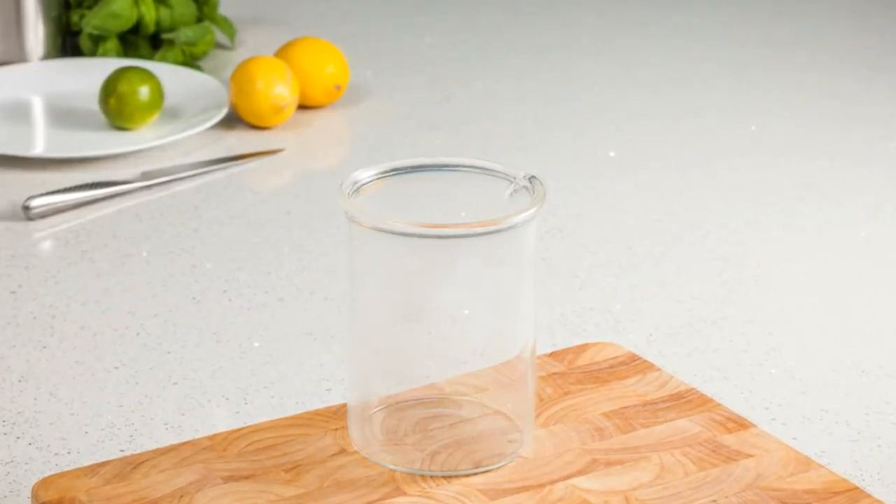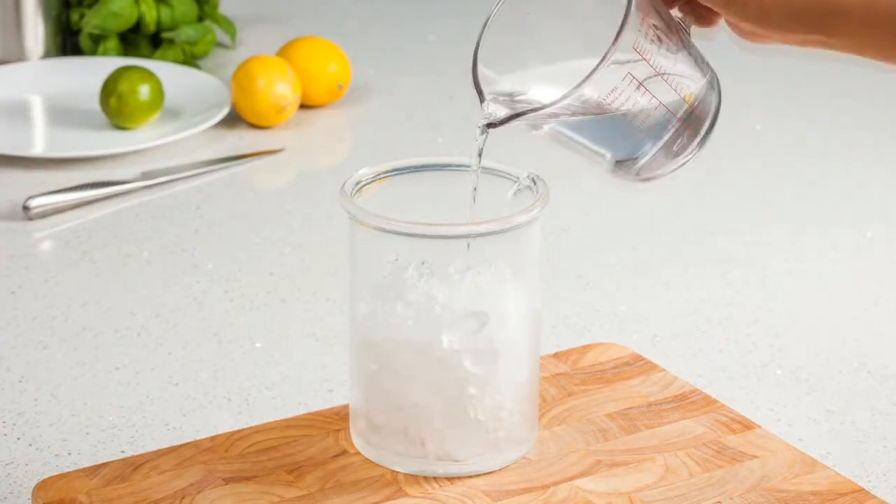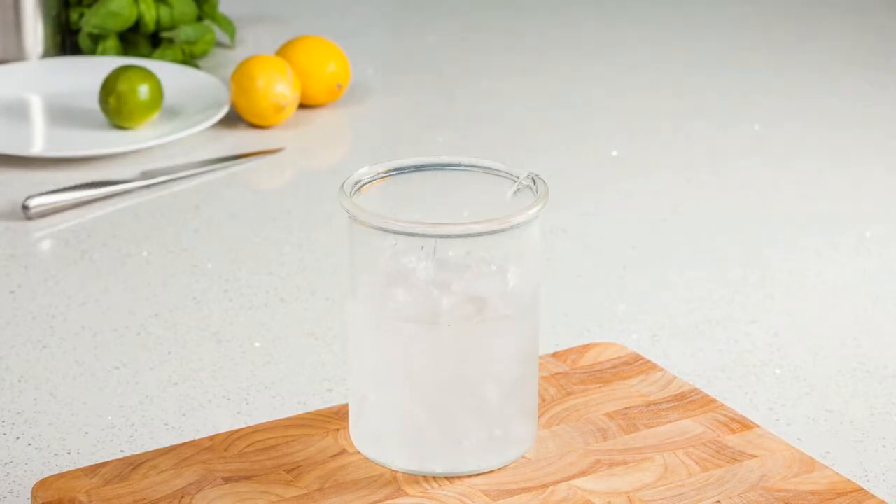Next, you'll need to crush enough ice to fill the container. Don't be tempted to use uncrushed ice such as standard ice cubes. Once the container is full, pour in cold water until the surface starts to turn from ice white to slightly grey in colour. The ice on the surface should show just a small amount of water and not an excessive amount.